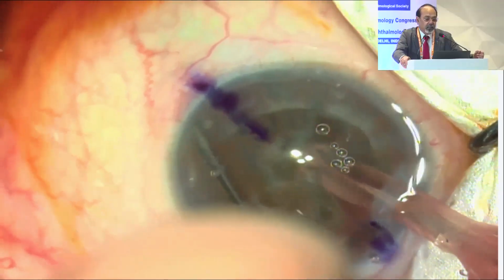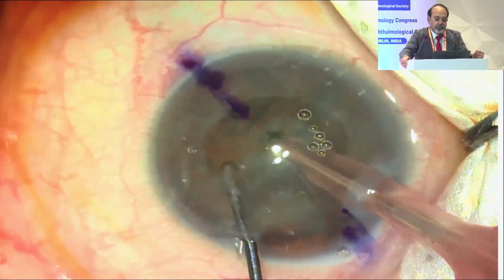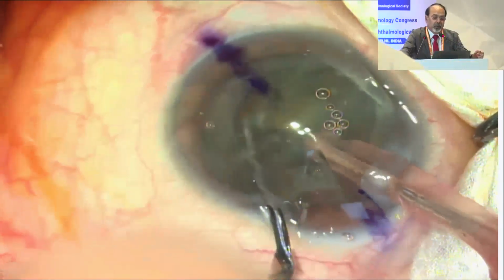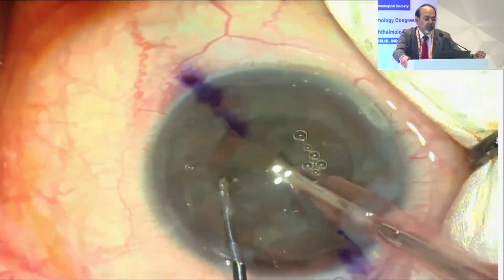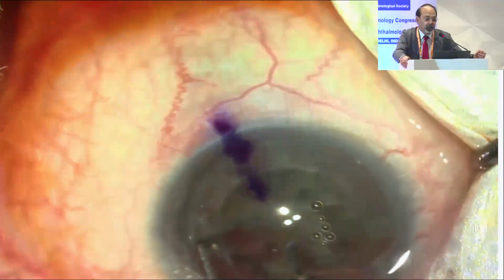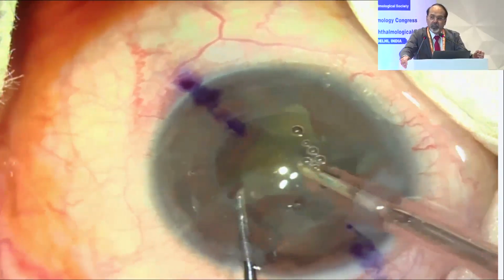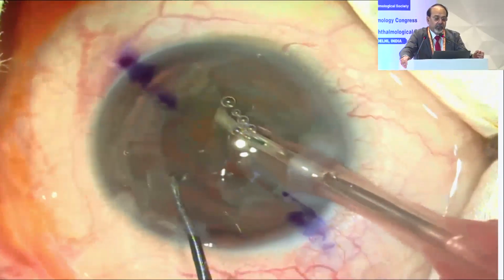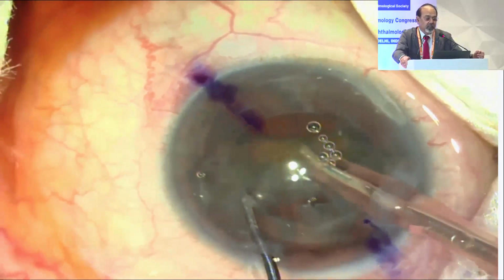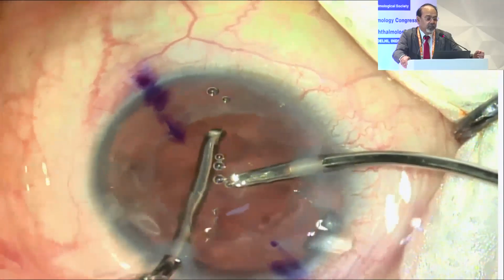There are marks, and you can see that I have gone between the cuts for my major incisions, which is the advantage whether you're doing it manually or with the femtolaser. And once I have divided the nucleus into multiple fragments, I'll remove these fragments one by one very quickly. They can be emulsified, because in this particular case it is probably a grade 2+3 or 3+ cataract.